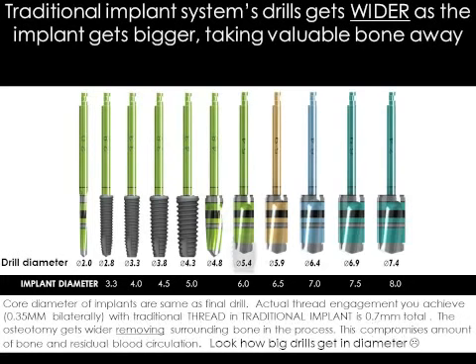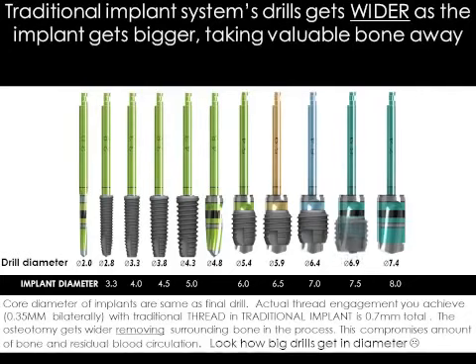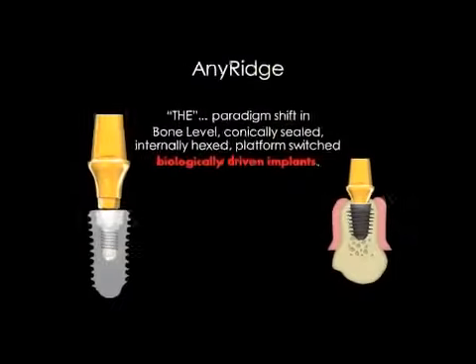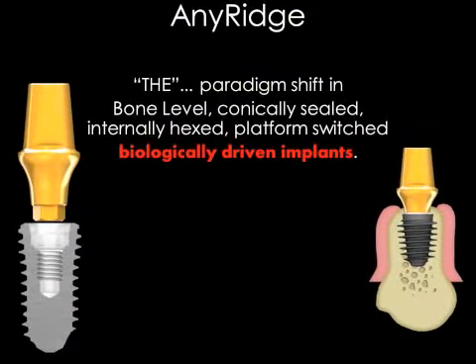People call it dieback and so forth regarding different types of ridges, because as the implant size gets bigger, again, you're compromising your crestal bone at the top, therefore decreasing the valuable blood circulation in the area. Again, look how big the final drill gets for an 8mm implant. It's 7.4 millimeters. That's a lot of bone to be taken away.